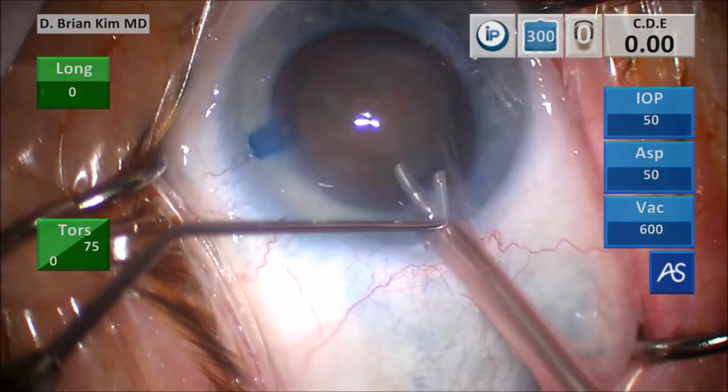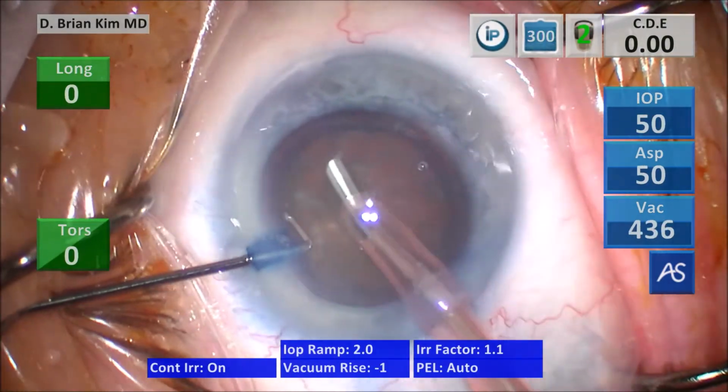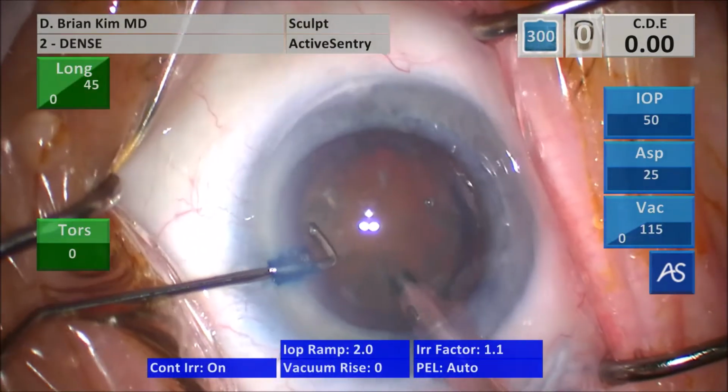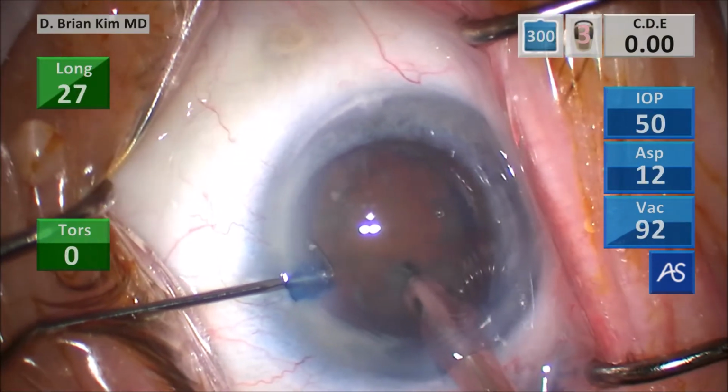Lifting the incision with the chopper, going in with irrigation off to minimize Descemet's trauma. With bevel down, I'm removing the surface epinucleal material, and I turn bevel up and I begin the sculpting. And this is a dense setting that I'm using. Go ahead and start sculpting.